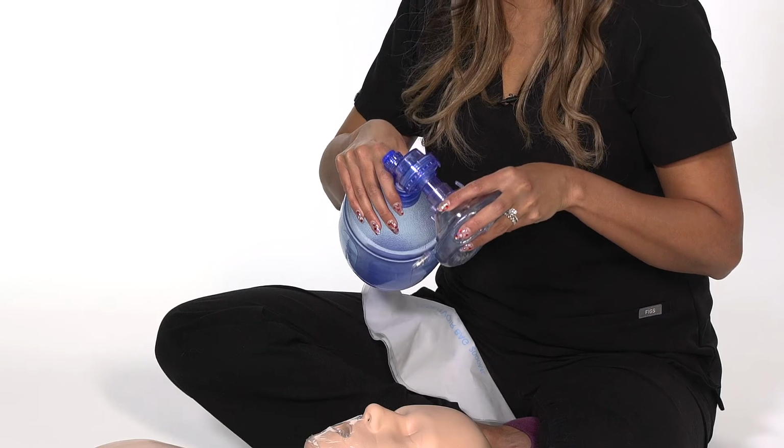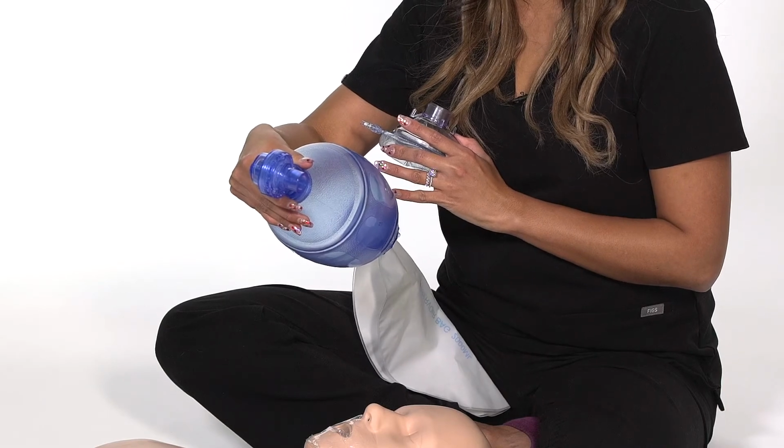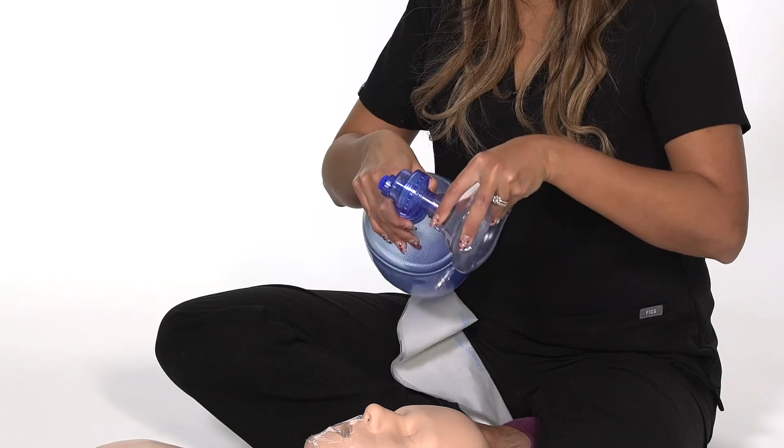We're going to call out the parts of the system here. It's actually going to come with a mask, the actual one-way valve bag mask device, and this is going to be connected to oxygen on the wall. So we're going to put these two pieces together.